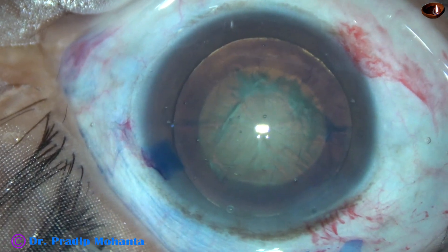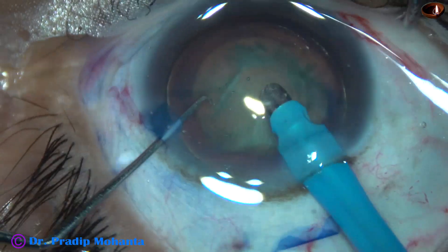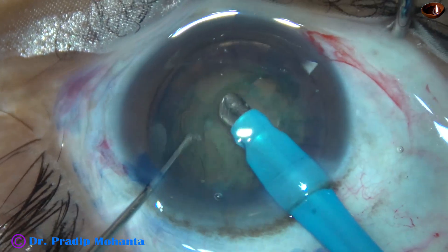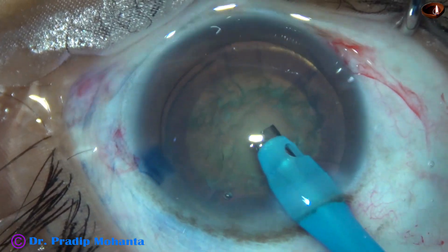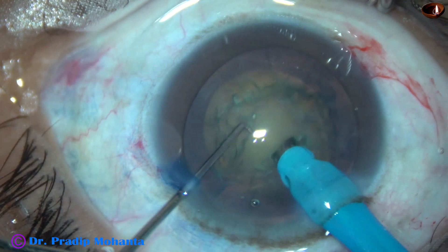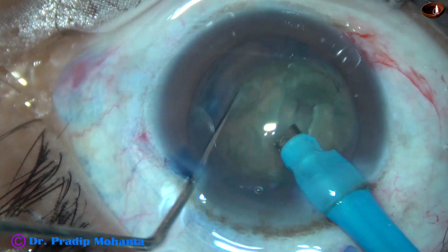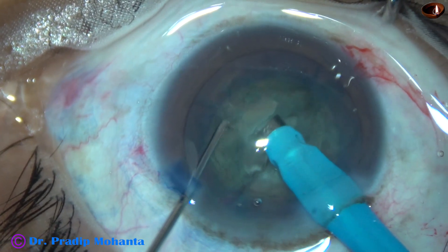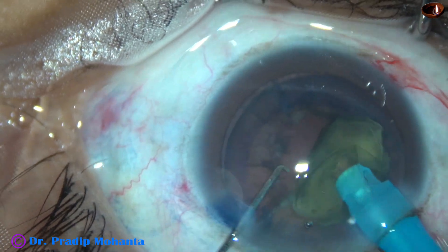And now is the time to use the phaco needle to emulsify the nucleus. I am going to do direct vertical chop in this case. Since the rhexis is not very large, it is safe to use vertical chop. With my small chopper, I am going to do this vertical chop. The tip is buried just in front of the phaco needle and the crack happens antero-posteriorly — that's why it is called vertical chop.